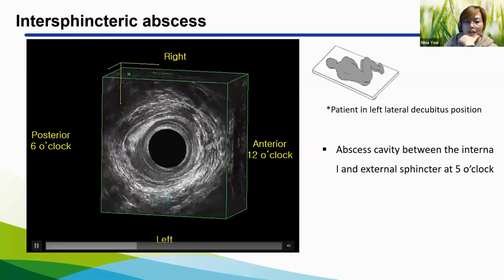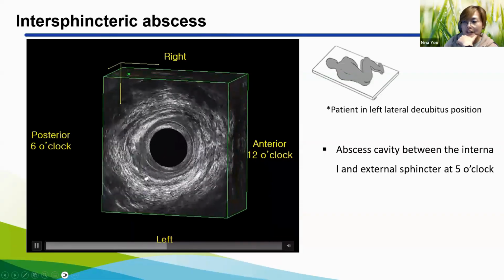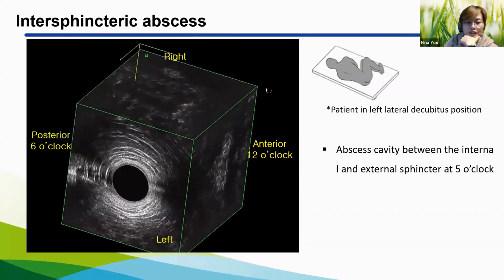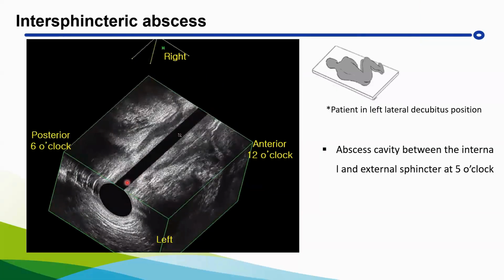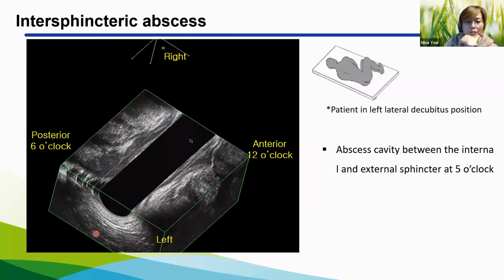The abscess is located right here. You can see that. Do you see my pointer? Yes. Okay. It's right here. You can actually see that it's in between the internal sphincter and external sphincter, and it's located right here.